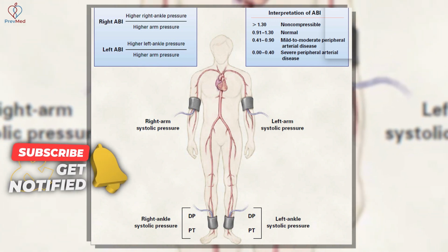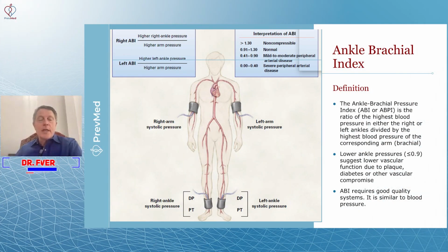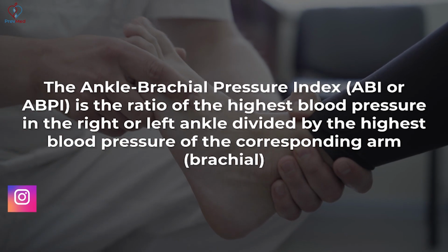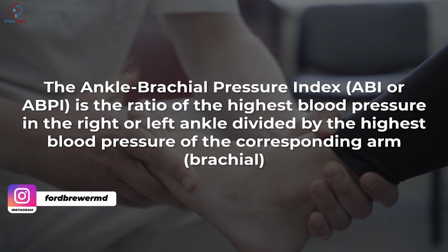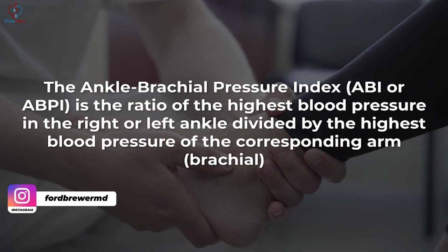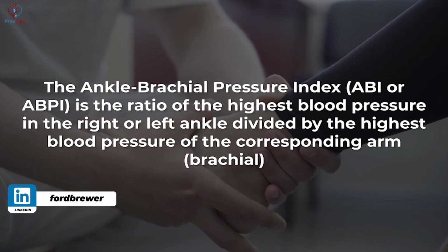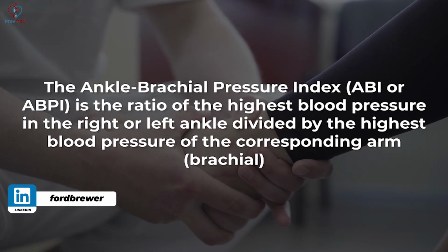Well, let's get a little bit deeper into the question today. So you see on this image that we're getting blood pressure in the arm, the brachial area, brachial blood pressure, and in the ankle, and we're comparing it. So here's the definition. The ABI, or ABPI, is ankle brachial pressure index. It's the ratio of the highest blood pressure in either the right or left ankles divided by the highest blood pressure of the corresponding arm, or the brachial blood pressure.